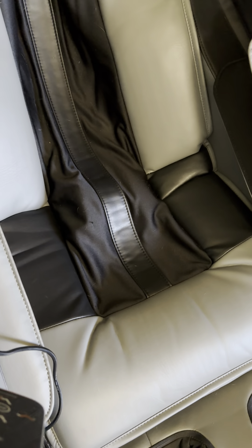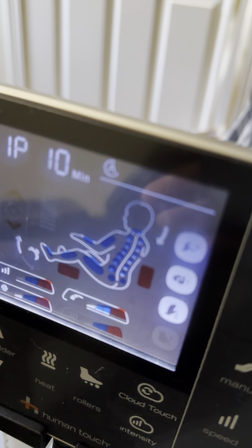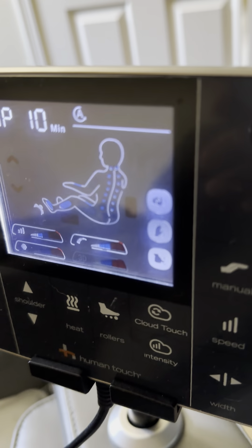So this is where it will not go up. You can see where it's stuck on the lowest setting and will not go up. It just stays like that, stuck down there in the seat.